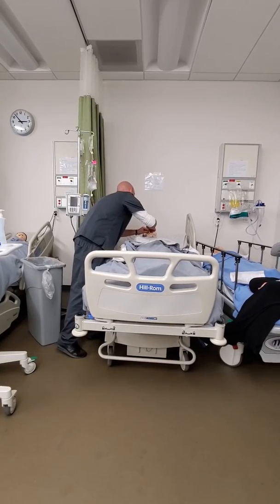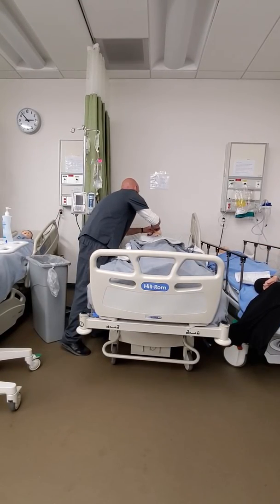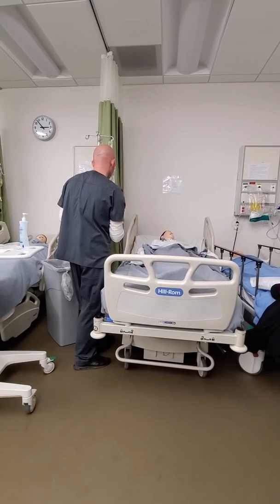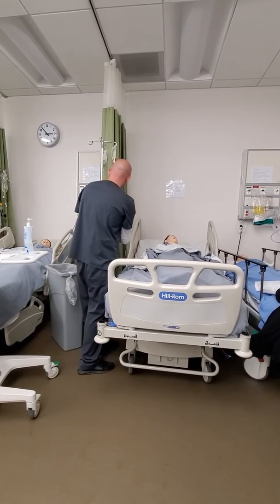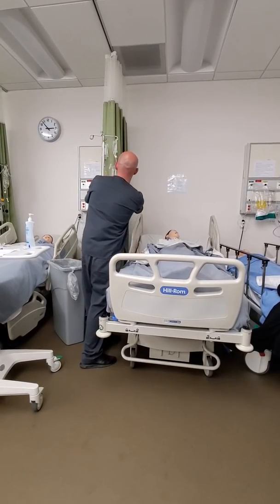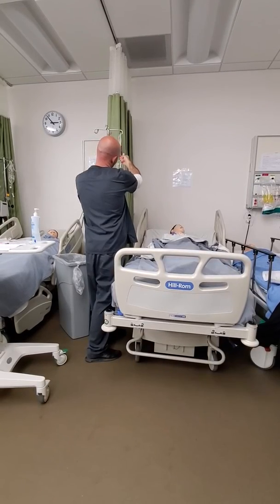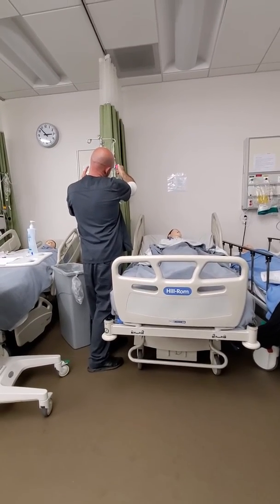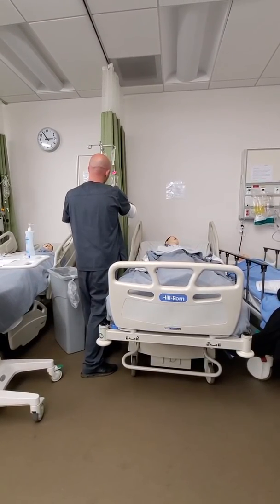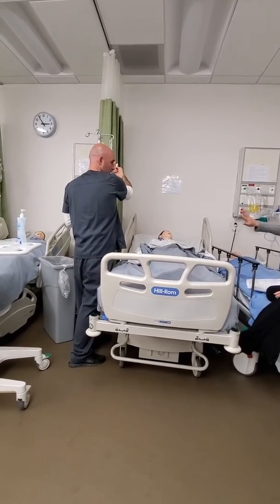And then be careful you're not tugging, as you flush and as you connect, you don't wanna tug on that central one. Okay, so once that's opened, I don't wanna get fluid in there, so I'm gonna open this. Remember it's clamped while it's in the pump. That's right, so this I can open, this I won't, but I would program my machine first and then open this, because it won't start infusing. It'll know that this is occluded in the pump, so you can open all your clamps when you're ready.